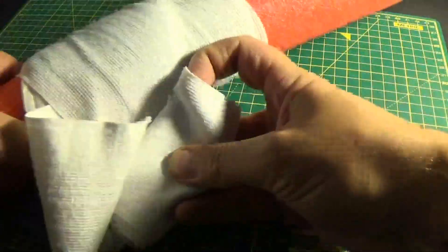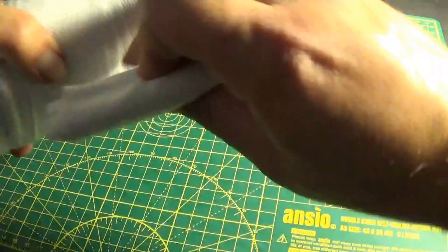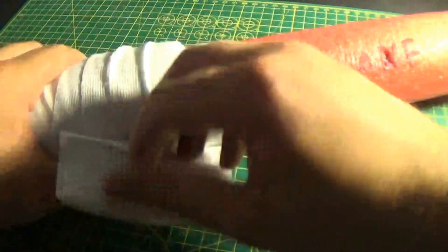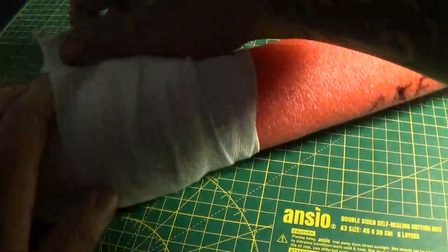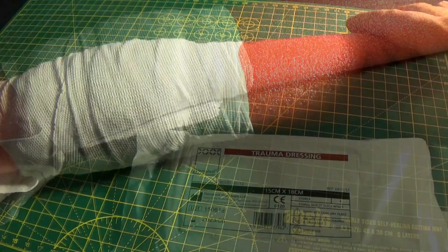You can go above, below, and over the wound — again pulling, stretching, and wrapping. We'll keep going over. Then as we come to the end, we have our Velcro — a really neat little feature there. We can secure the dressing in place to look good when you get that person to the hospital.